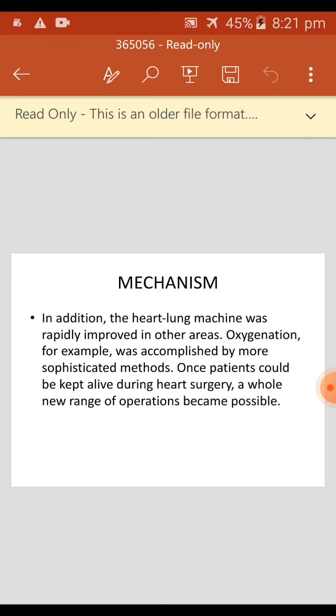Tubing sizes range from a diameter of 1/8 and a wall thickness of 1/16 to 3/16 and 1/4 for pediatric applications with correspondingly low flow rates. Tubing for adult application is usually in the range of 3/8 or 1/2 with a wall thickness of 3/32, facilitating flow rates of more than 10 liters per minute.